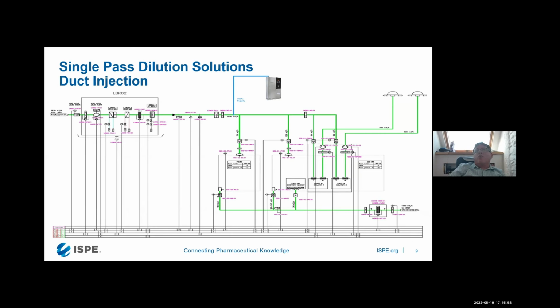The 1 ppm is kind of a global rule. It's 0.5 in Switzerland, but it's a main rule for an exposure of 8 hours for the people. So there are some limits for instant concentration for the US, but there is no real general rule. The only general rule is for the long exposure, and this is 1 ppm we are normally taking into consideration. Thank you.